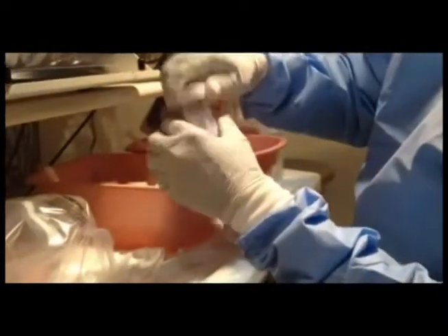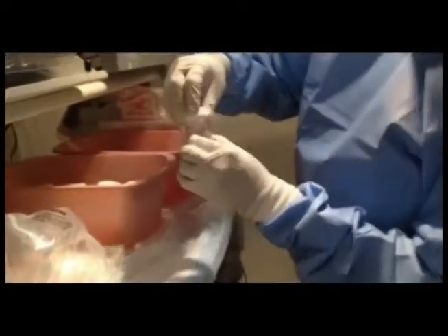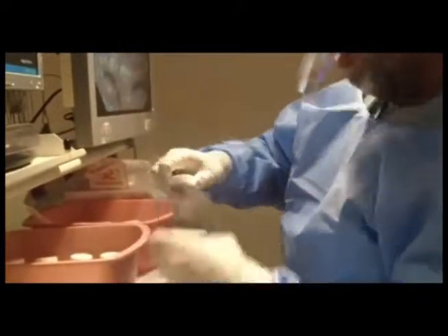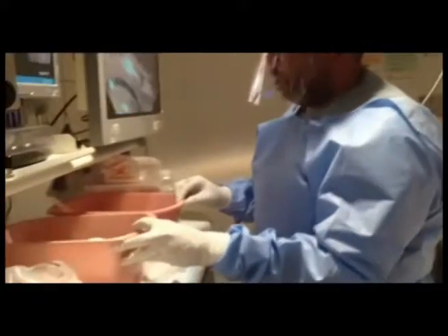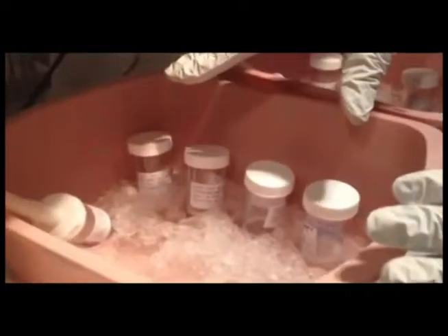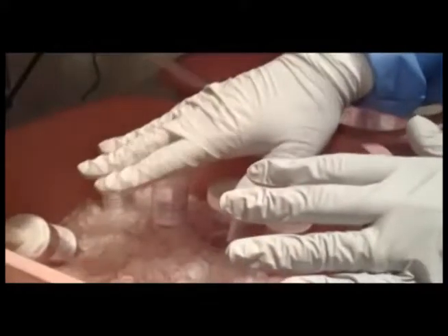The first specimen is sent to the laboratory for standard electrolytes: sodium, potassium, chloride, and bicarbonate — kept on ice. The next sample will be sent for proteomic analysis. We have beautiful pure pancreatic juice going to the proteomics lab, all kept on ice. All specimens are kept on ice; these are the samples used for proteomic and laboratory analysis.